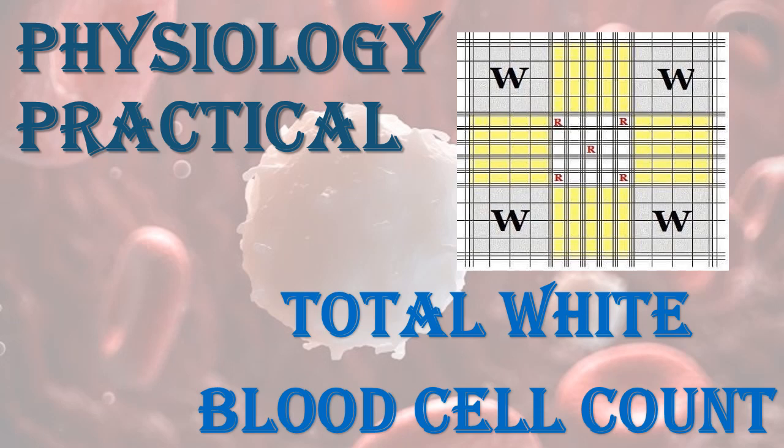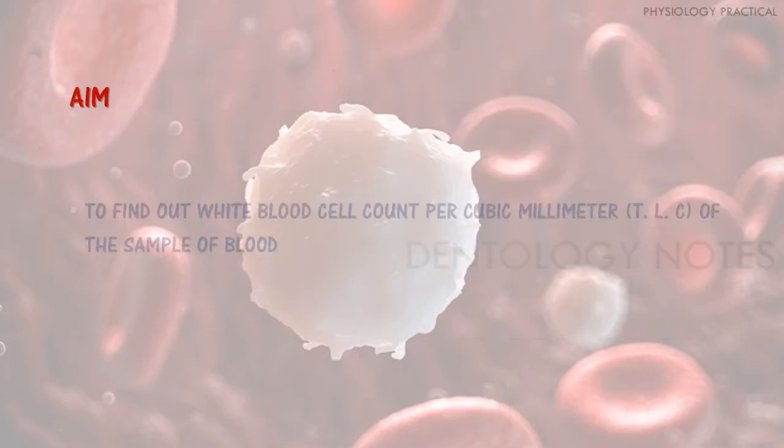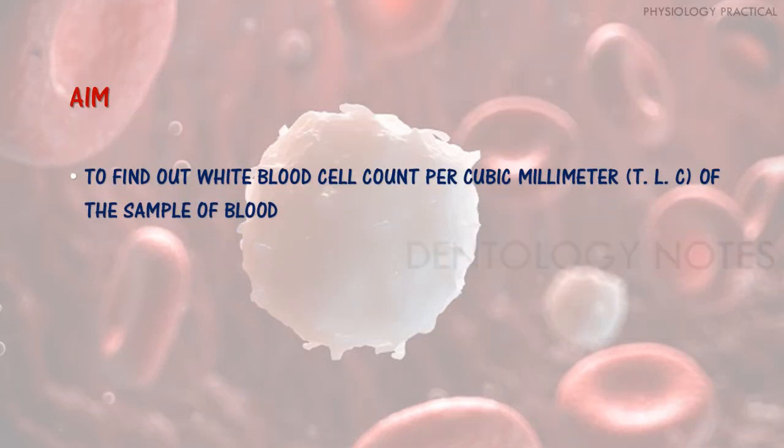Hi guys, in this video we are going to discuss the physiology practical, total white blood cell count, in detail. Aim: to find out the white blood cell count per cubic millimeter, TLC, of the sample of blood.